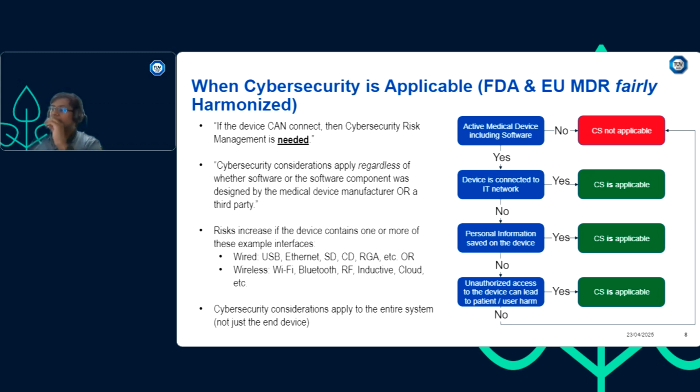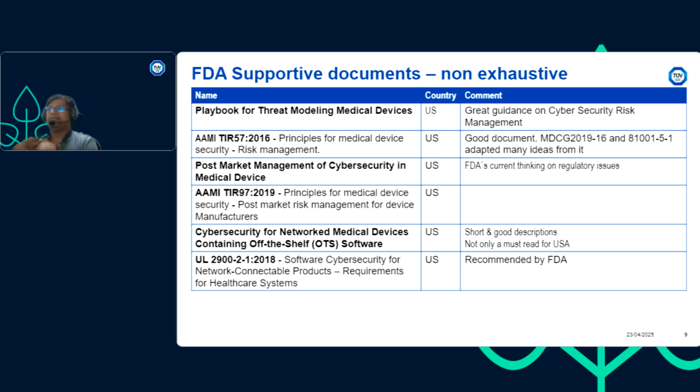Now, what can be the base documentation we should refer to, or at least consider, to understand cybersecurity in more detail? Because we say we should do threat modeling, we discuss penetration testing, vulnerability scanning, off the shelf components, and third party applications and software. All these we discuss, but where can I read more in detail, obviously.